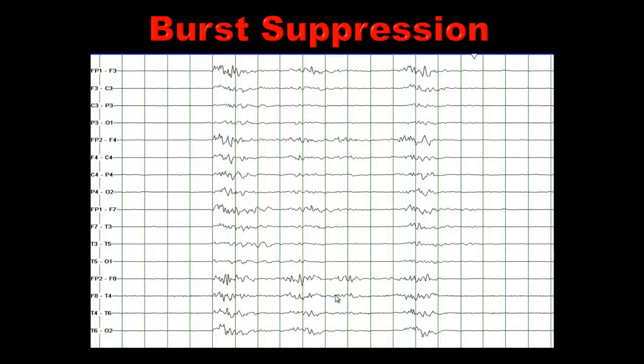Burst suppression can be chemically induced. In patients who are in status epilepticus, sometimes they will be given medications that produce this pattern — high doses of Propofol, Pentobarbital, other benzodiazepines, or general anesthetics. If it is chemically induced, it does not necessarily indicate a poor prognosis. But if you see a burst suppression pattern in severe anoxic brain injury in the absence of any medications, it tells you of a poor prognosis for functional recovery. Likewise, in Ohtahara syndrome, burst suppression indicates a relatively poor prognosis. Before making any prognostic determinations, the patient needs to see a neurologist or pediatric neurologist who is an expert in this area.